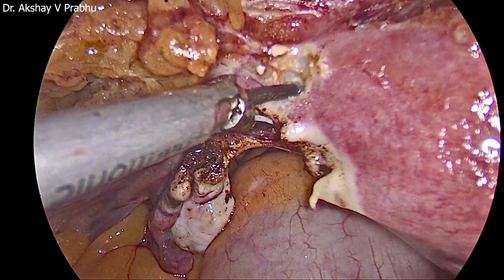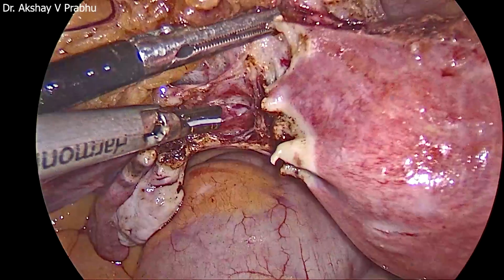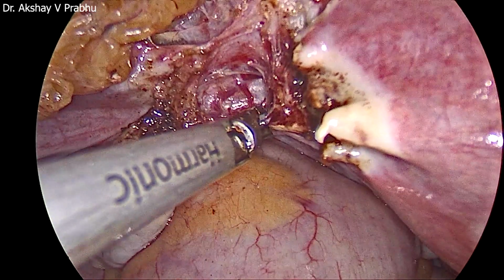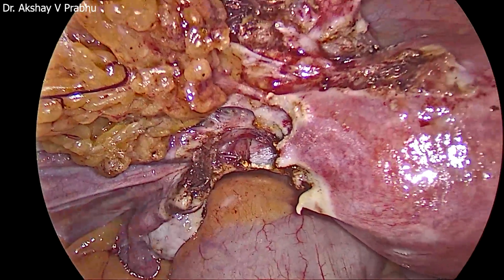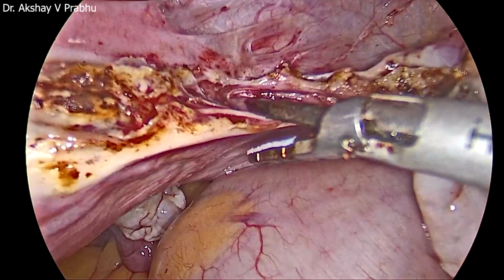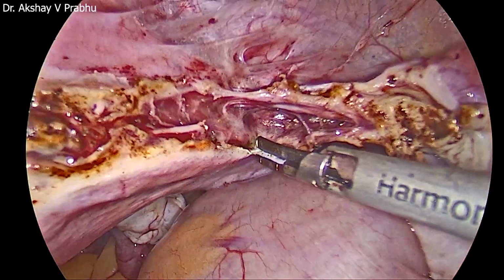Even till now, we have not been able to locate or demarcate a clear space or clear virgin plane for dissection of the bladder. Still we are searching, so be very patient in such cases. Now I'm cutting more towards the uterosacral ligament. You'll have to go millimeter by millimeter. See the central plane, see the lateral plane, whatever opens up, you just have to pray and keep on trying.